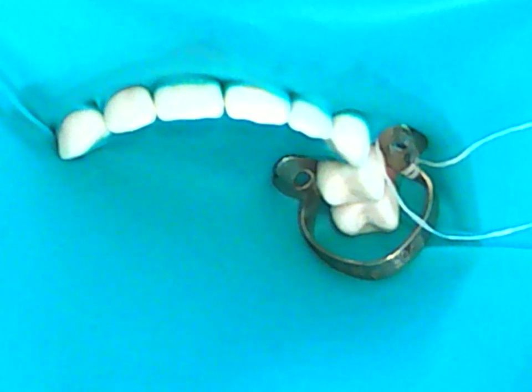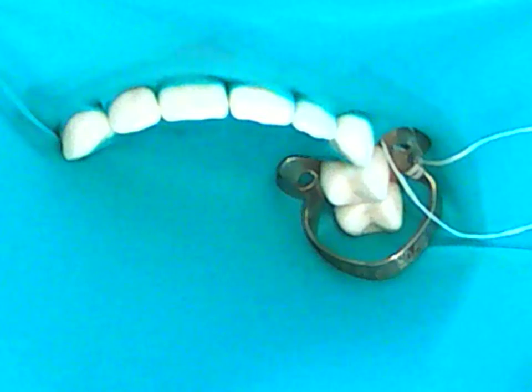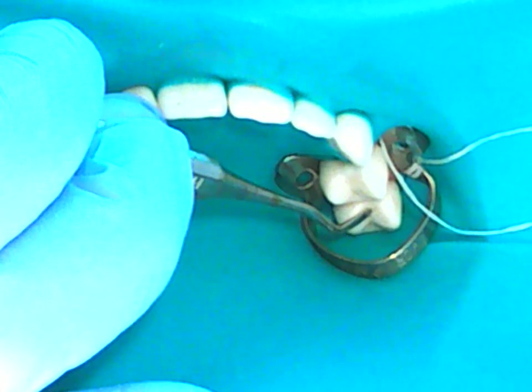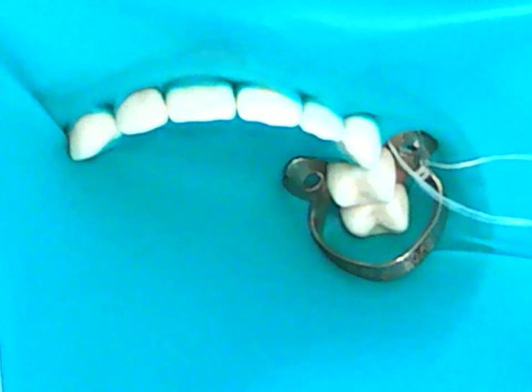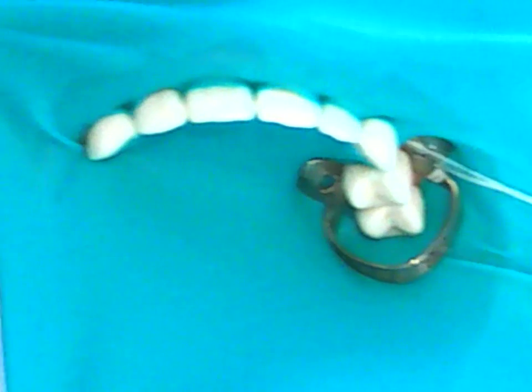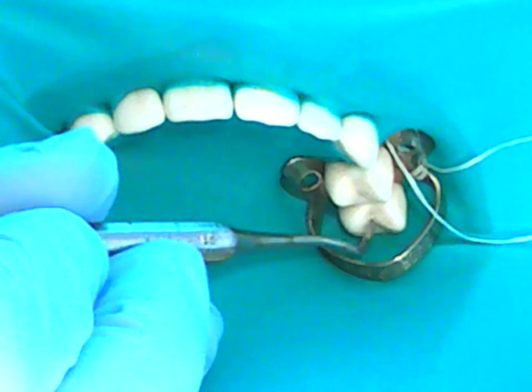Okay, so it's pretty much through all the contacts. This isolation is from tooth number 2-4 to 1-3. Do you notice how the 2-5 is exposed? That does happen for isolation, or if you have another molar behind your anchor tooth. This happens quite regularly. So what you do to fix that is cover that 2-5 up with the dental dam.